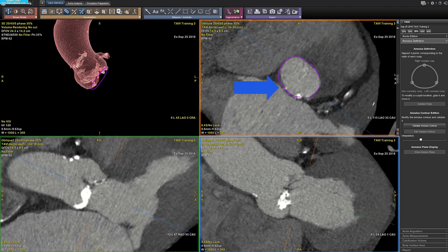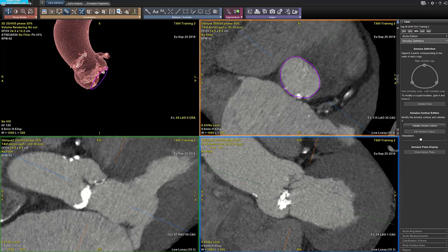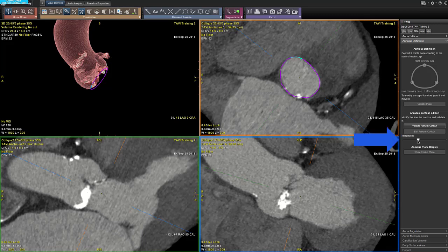A pre-contour of the aortic plane is displayed. You can modify or edit the annulus contour. On the upper right viewport, place your cursor on the annulus and modify the shape or the contouring. You can use the interpolation tool on the wizard panel to choose the length of the additions.